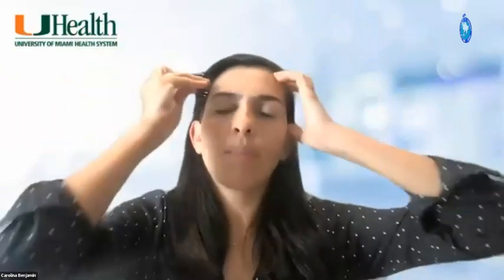Yeah, so I do think that prior embolization leads to more difficulty. What happens with prior embolization is that it makes it more difficult for us to identify what the actual target is. Not always, but depending on the amount of embolization, you can be limited and you can miss part of the nidus, right?